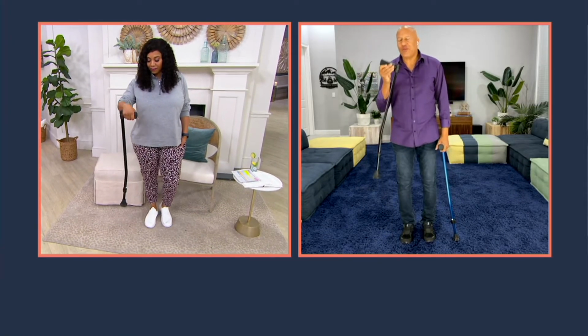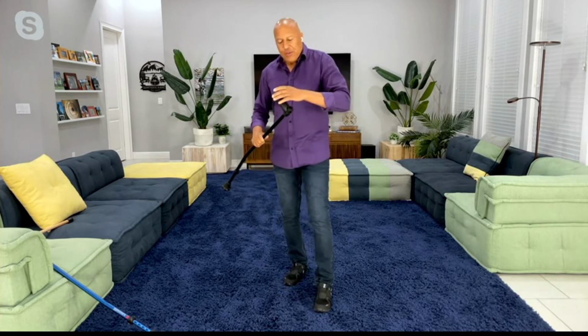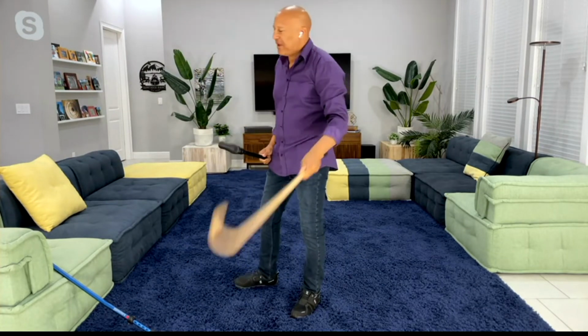Yeah, so the other part about this is the grip, and the grip is really, really important here. There are people out there that are a little older, like me, I'm 64, and you get a little arthritis, you get a little hand pain, you're not as strong as you used to be. So it's important not to have something like this. A really thin grip is not good for you because you can't hold on to it.